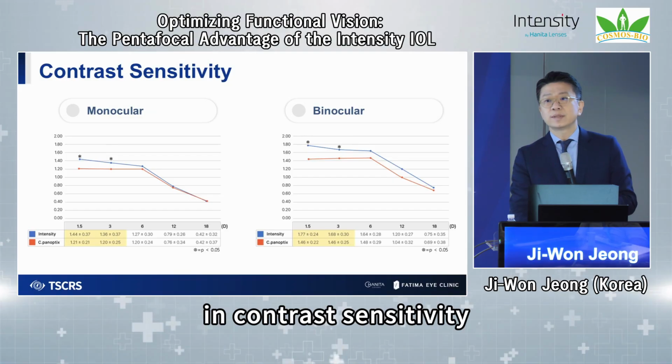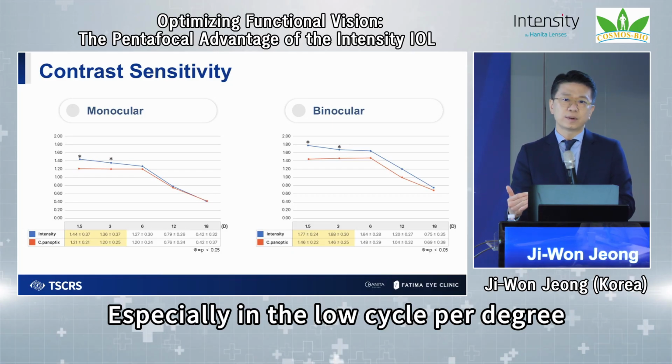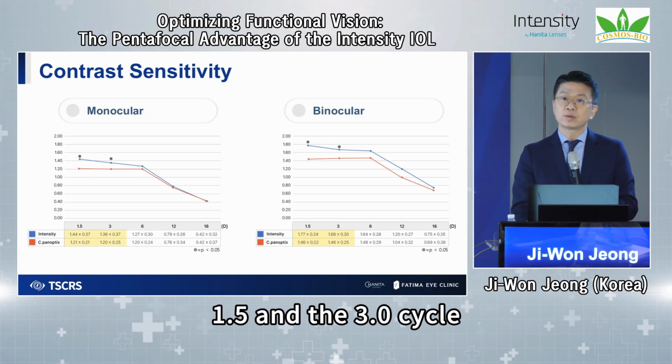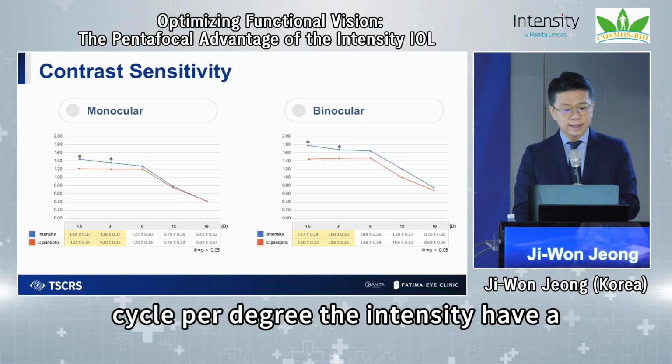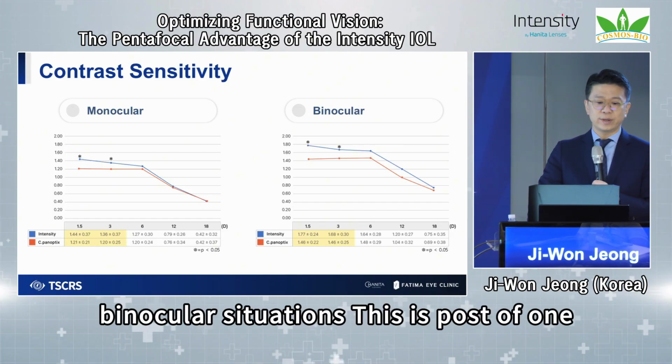In contrast sensitivity, the Intensity group also has better results, especially at the low cycles per degree, 1.5 and 3.0 cycles per degree. The Intensity group has better results in both monocular and binocular situations.